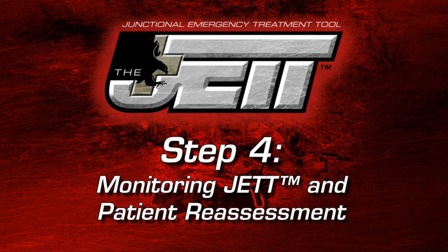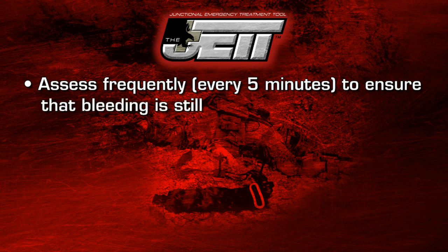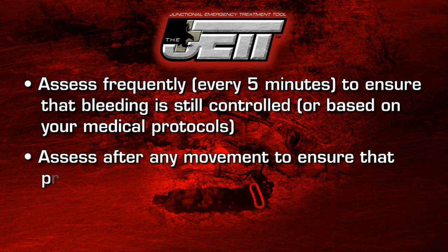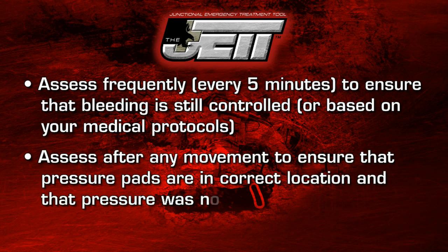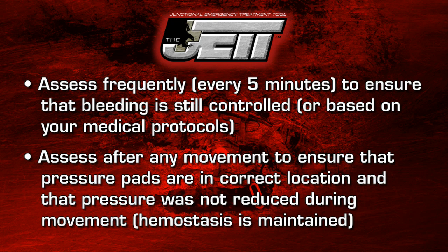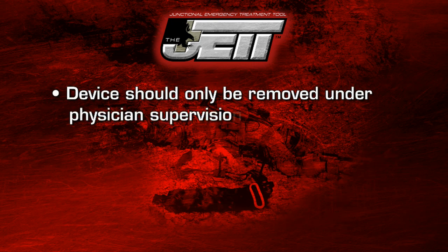Step four: monitoring JET and patient reassessment. Assess frequently to ensure that bleeding is still controlled. Assess after any movement to ensure that pressure pads are in the correct location and that pressure was not reduced during movement. The device should only be removed under physician supervision.